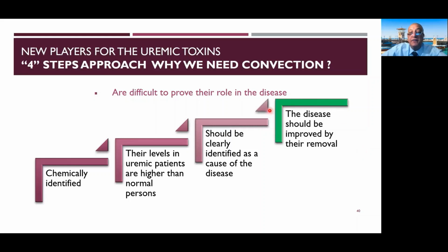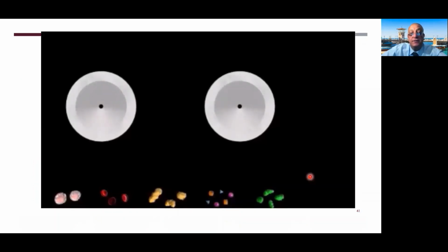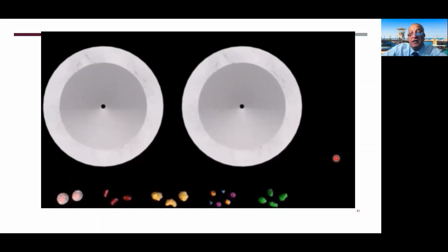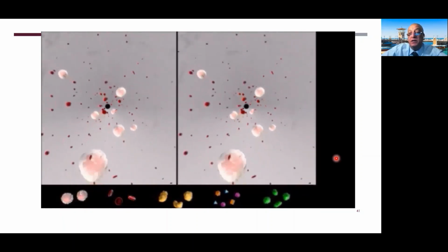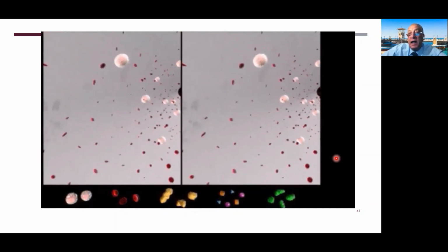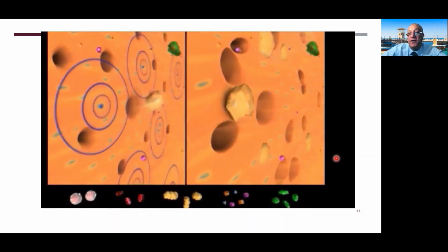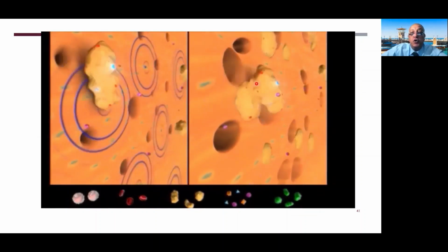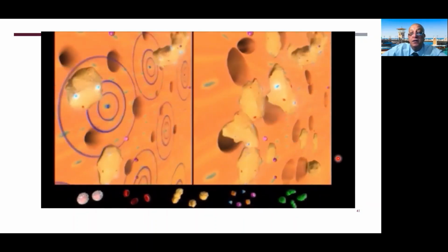So regarding uremic toxins and their value, going from low flux to medium cutoff in current use, I think hemodiafiltration has generally gained acceptance nowadays among most nephrologists. The effect of adsorption is a constant process, because you can remove more protein-bound uremic toxins by adsorption to the membrane, but against that is filtration failure, as clogging inside the filter increases with time, especially after 30 minutes of the dialysis therapy. So protein adsorbed on the wall clogs the porosity and impairs the filtration capacity of the dialyzer.